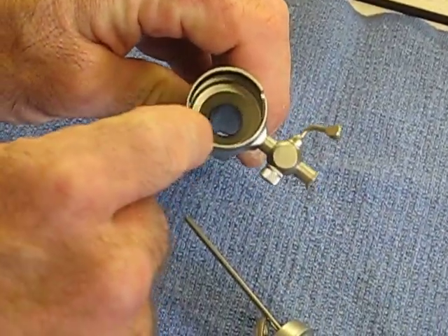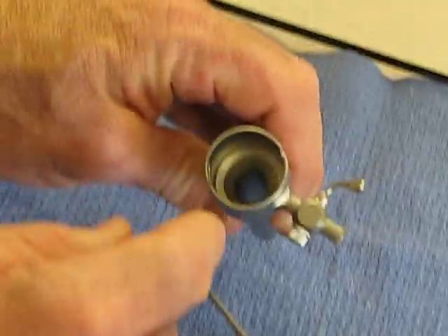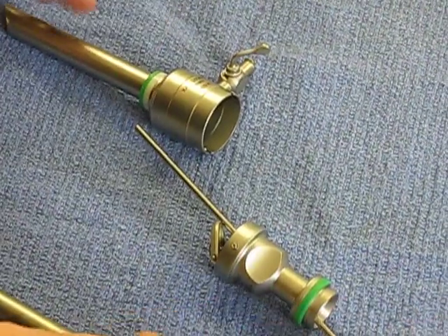Then you also want to clean the barrel of the cannula with a brush or cotton tip applicator. Then let it dry.